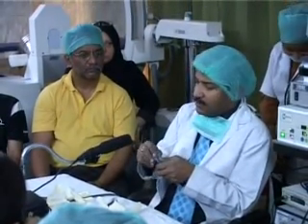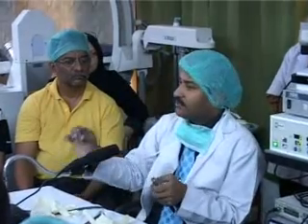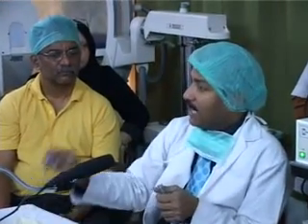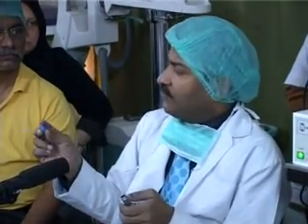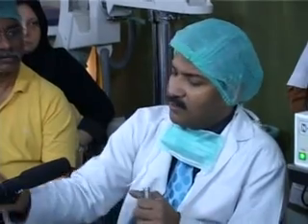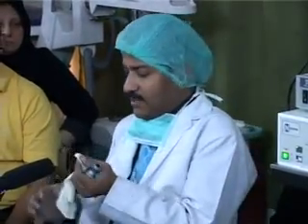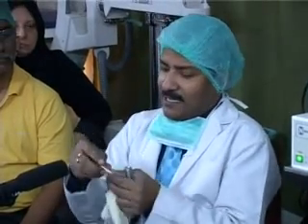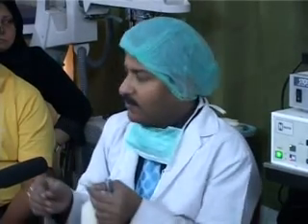Now my question is, what will you do if you don't have this one? If you don't have this one, then you have to do surgery. And if it is leaking, pardon? A wet gauze piece will not solve the problem. No. What do you do? Take one scissor and cut the finger of the gloves at 2 places. I will show you how to solve the problem.